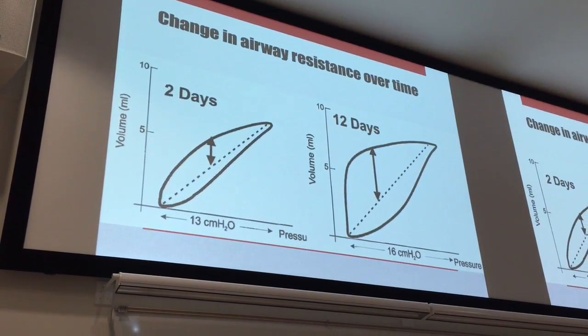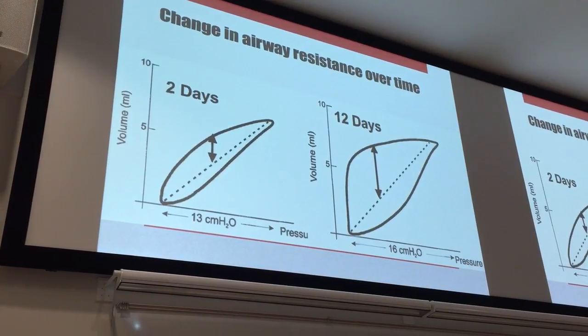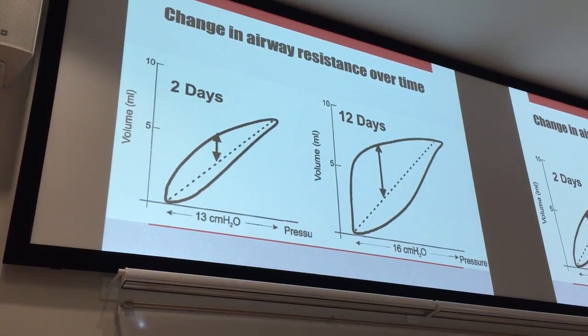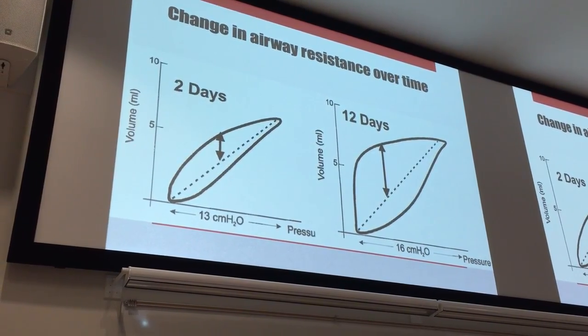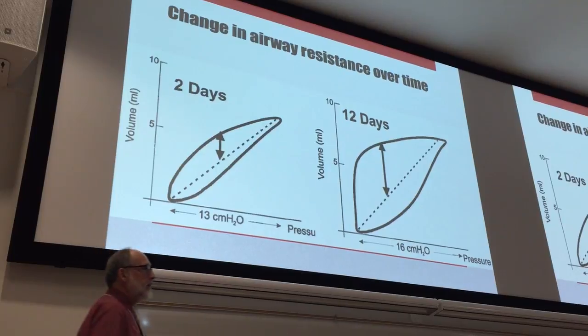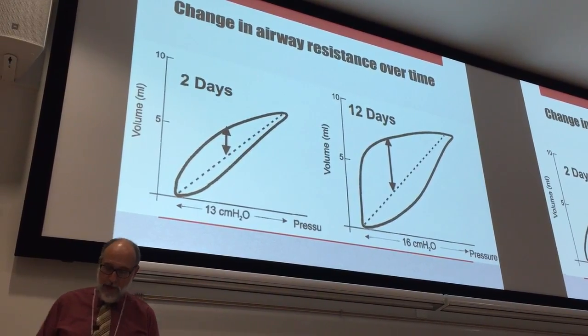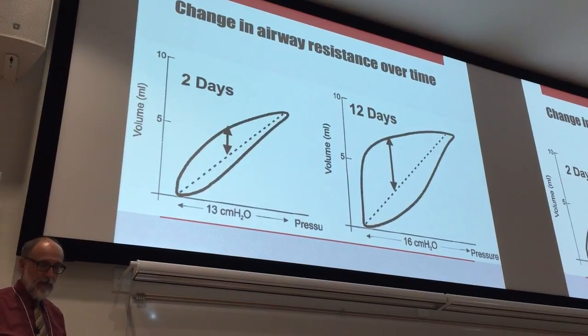That means pay attention to your expiratory time to avoid air trapping, pay attention to your inspiratory time. So pathophysiology evolves over time, and the right settings on Wednesday may not be the right settings on Friday. So we need to reevaluate and make sure we know what we're doing.